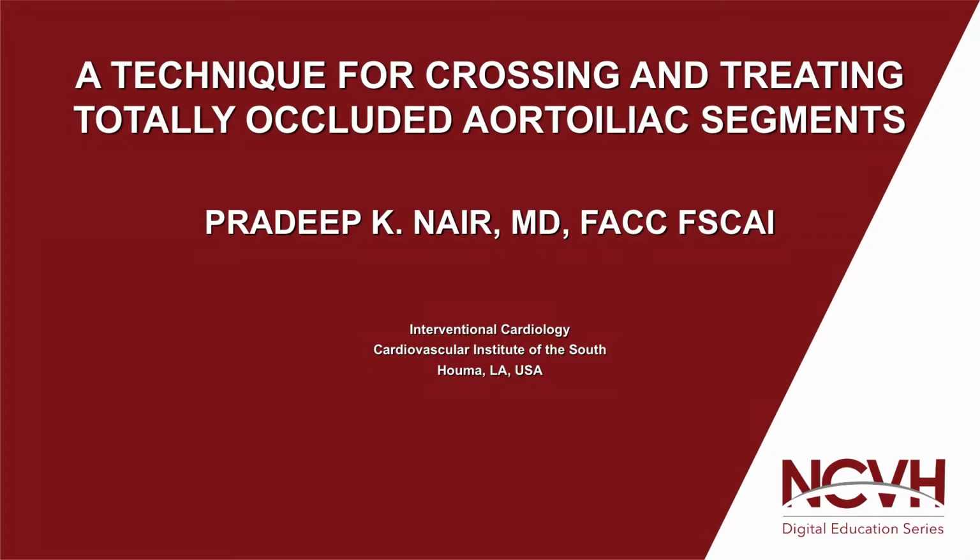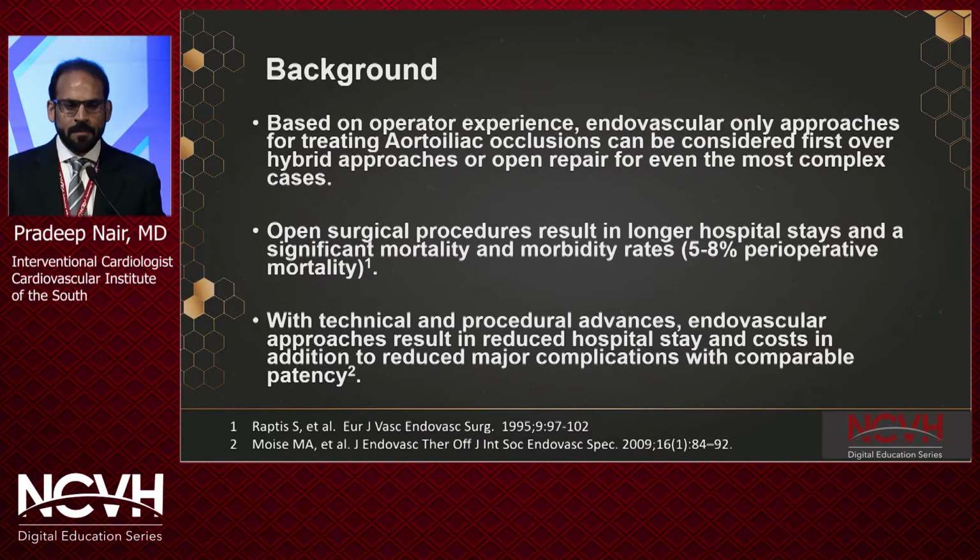Going to talk to you about a technique for crossing and treating totally occluded aortoiliac segments. Here are my disclosures. So the background, I'm going to propose that based on operator experience, endovascular-only approaches for treating aortoiliac occlusions can be considered first over hybrid approaches or open repair for even the most complex cases.